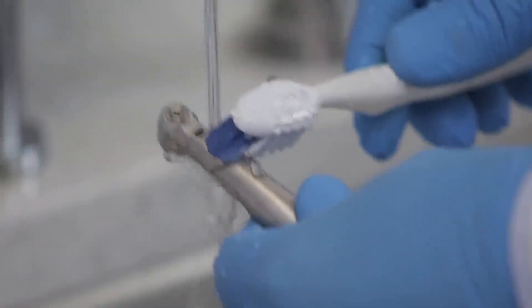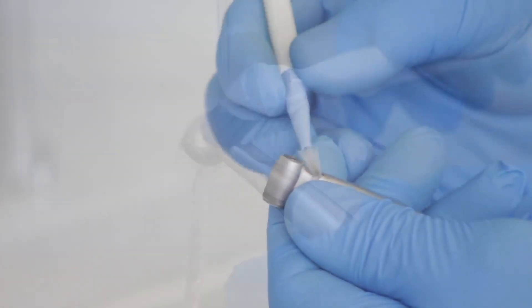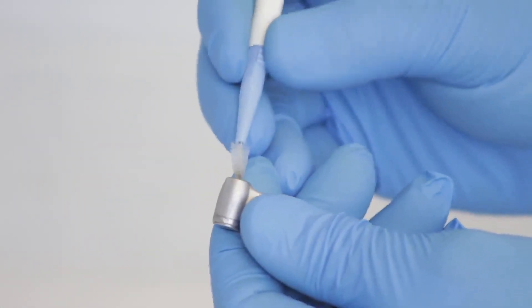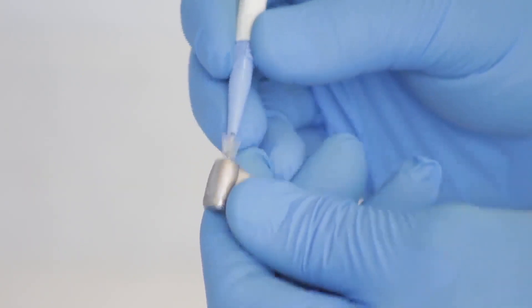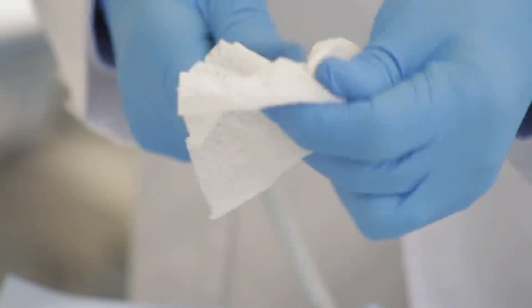Thoroughly clean the external surface of the attachment with a soft toothbrush under running water. Clean inside and around the chuck or the burr insertion hole using an interdental brush. Wipe it dry with a paper towel.